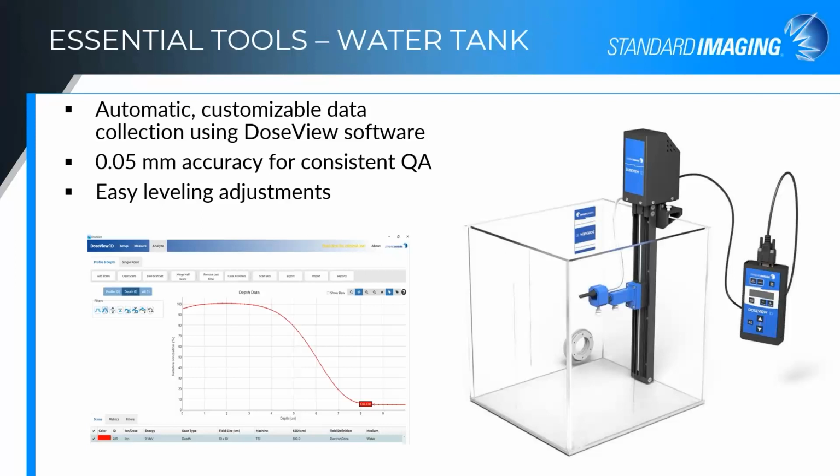Excellent. Oh, I had a question that I missed. Is the diode shielded or unshielded? It is unshielded. So it is good for both photons and electrons.